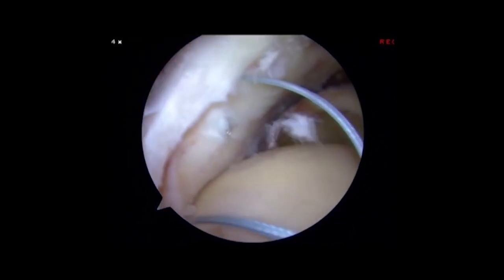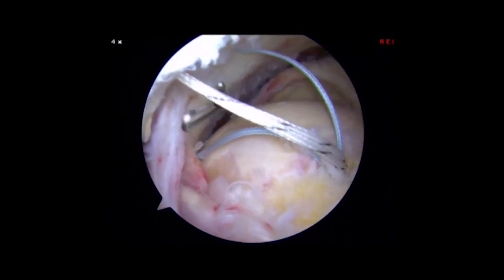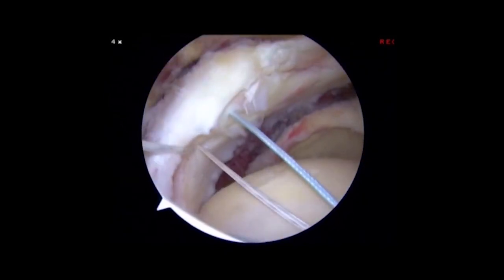The 50-yard line view for the arthroscope is promoted by the authors because it allows us to see the underlying superior capsule and appropriately incorporate that capsule into our rotator cuff repairs.